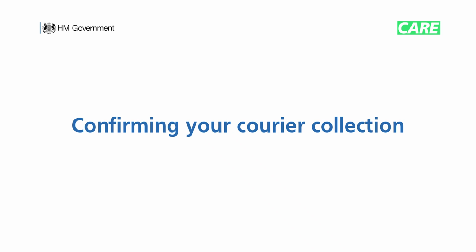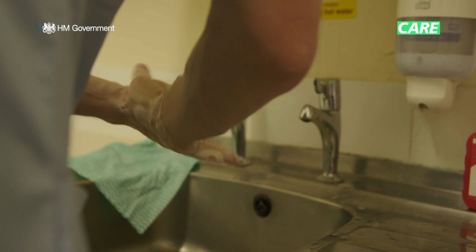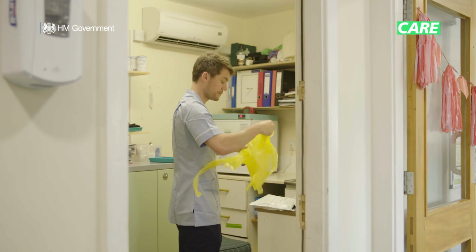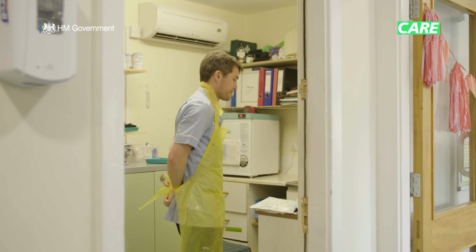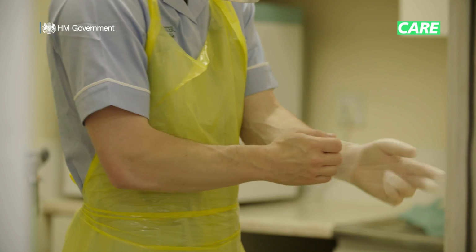The completed test needs to be sent to the lab quickly, so before you do it, make sure you've confirmed a collection time with your courier. Before you touch anything, wash your hands thoroughly with soap and warm water for 20 seconds. As you perform the test, both you and your colleague should be wearing the necessary personal protective equipment. Apron, mask, visor, then gloves.